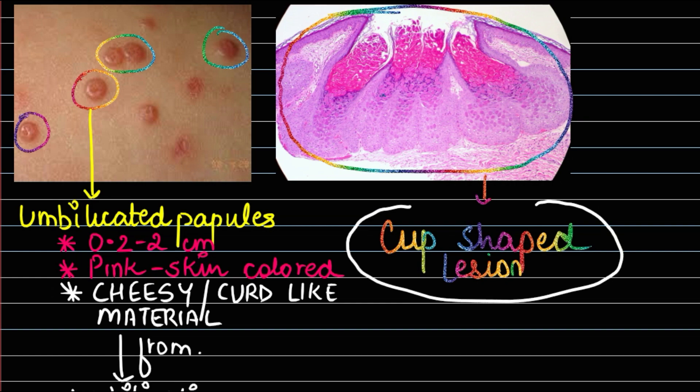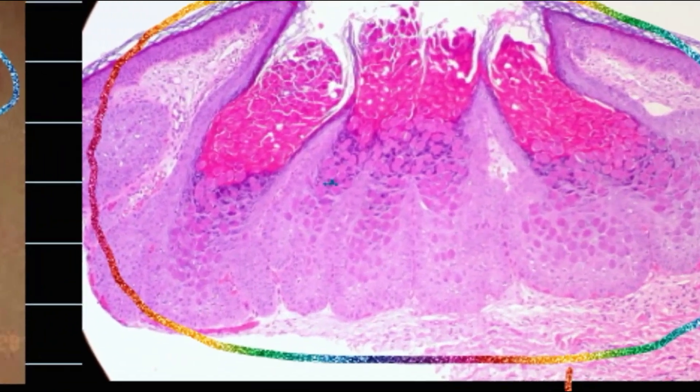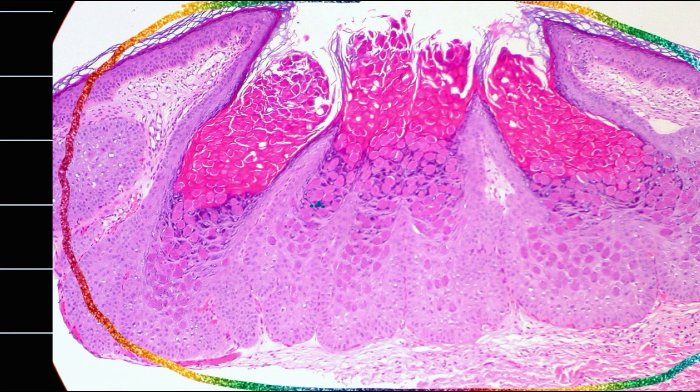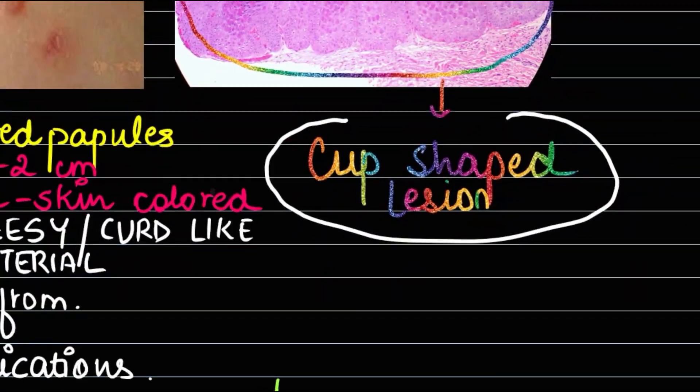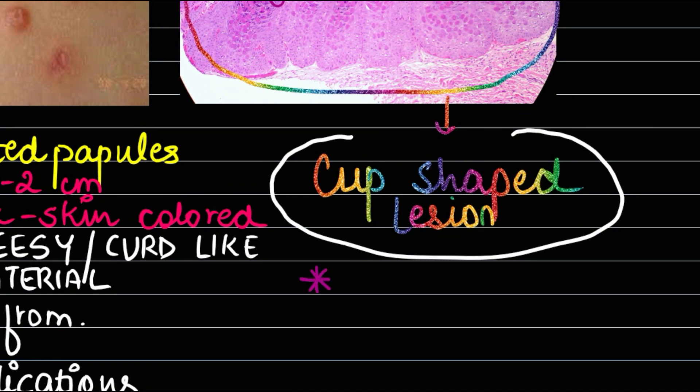Let's zoom in to this image. You can see pink-colored bodies throughout. These pink inclusions have been given a special name - molluscum bodies.